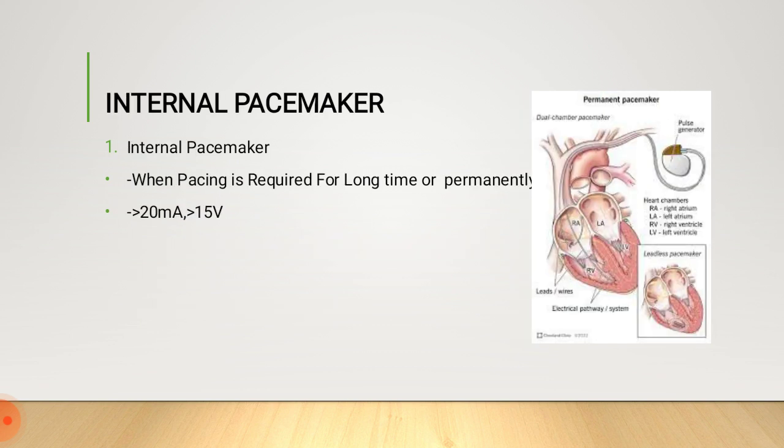Internal pacemaker. When pacing is required for a long time or permanently, we use the internal pacemaker. This is a device implanted in the human heart or abdomen by surgery. It produces electrical impulses to prompt the heartbeat at a normal rate.